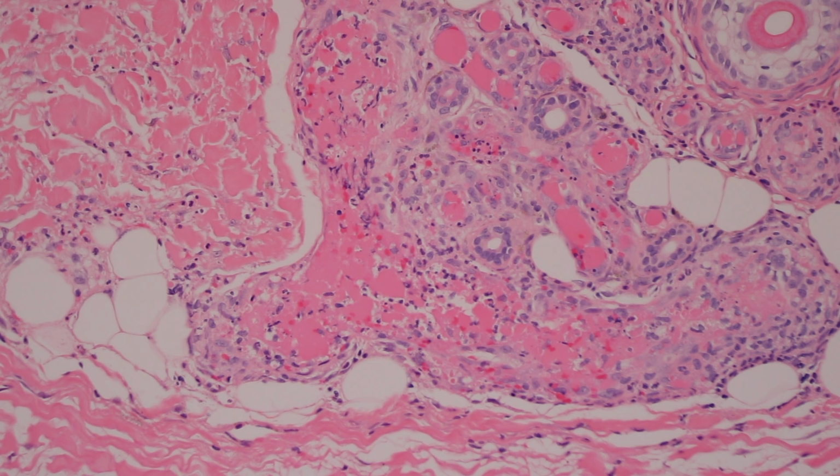cryoglobulins in your differential. And in fact, anytime I see what looks like thrombi filling vessels, either with or without vasculitis, I tend to like to put a comment to make sure that cryoglobulinemia is excluded. Usually though, you can kind of suspect cryo because it looks, like I said, more dense pink, and it's kind of glassy. And if you're lucky enough to get an immunofluorescence with it, it will actually stain differently.